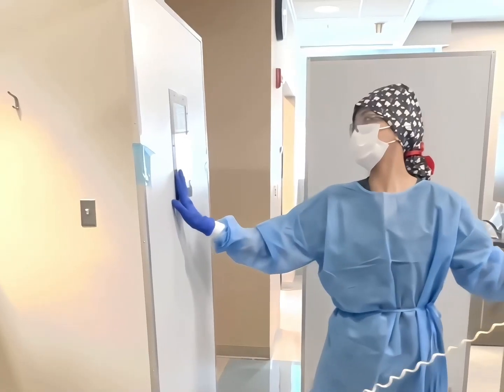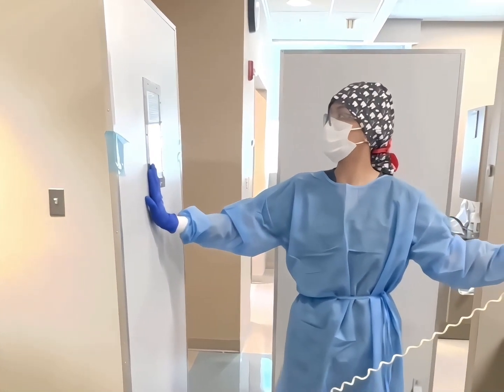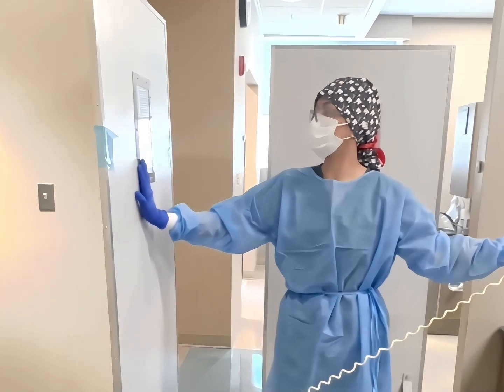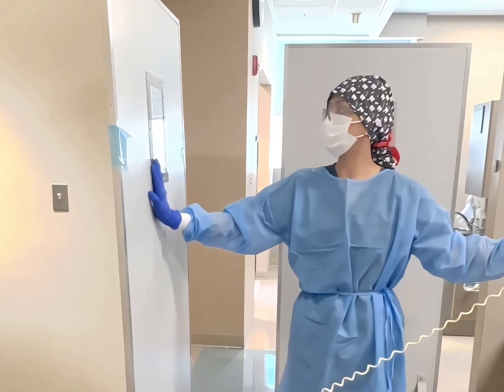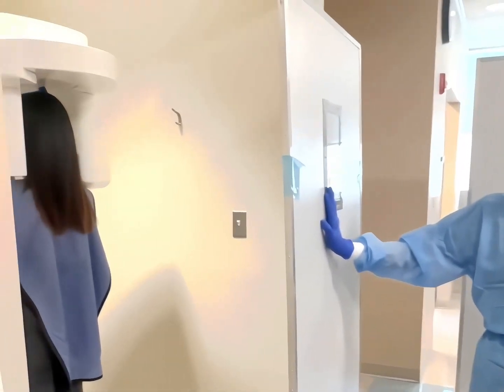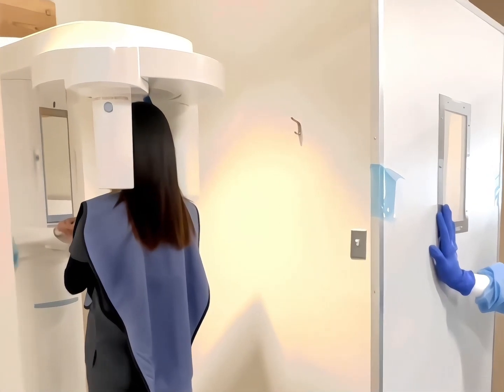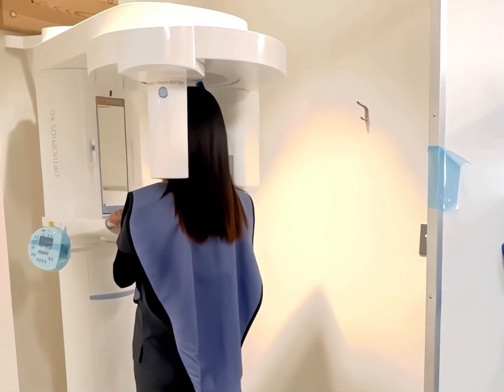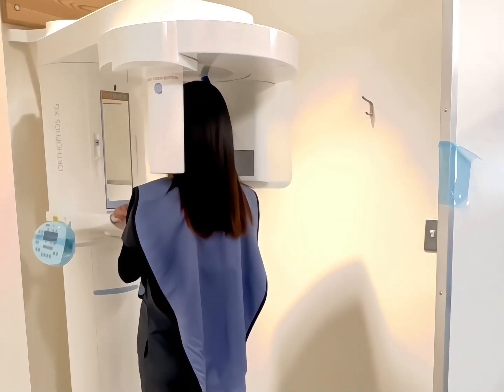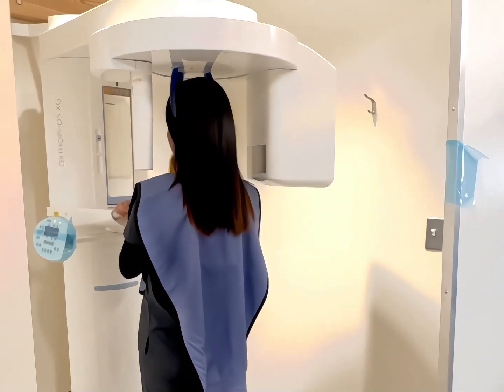Say X-ray, press and hold for the duration of the exposure until you hear the 3 beeps. If you let go too soon, an error message will occur and the image may need to be retaken. As the exposure begins, the X-ray tube will rotate around the patient's head. The movement of the X-ray tube allows for the image capturing the entire dentition.